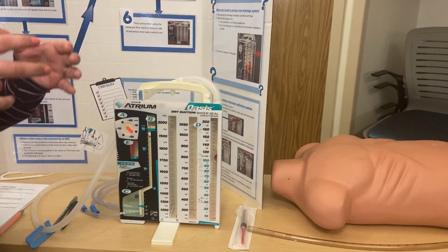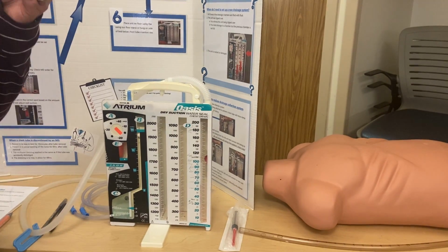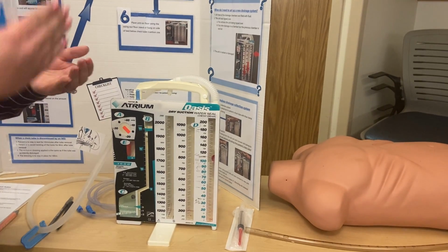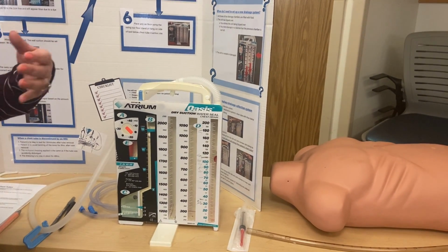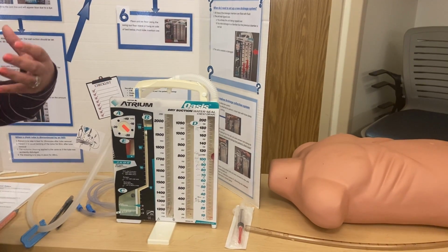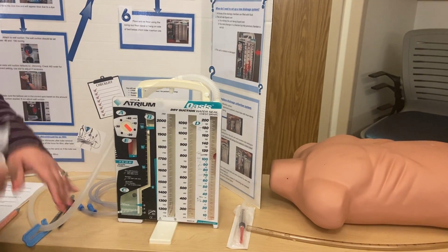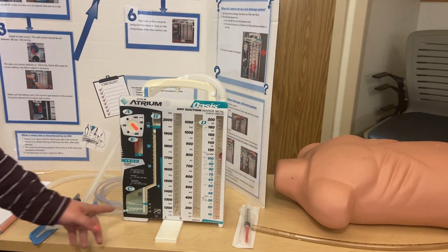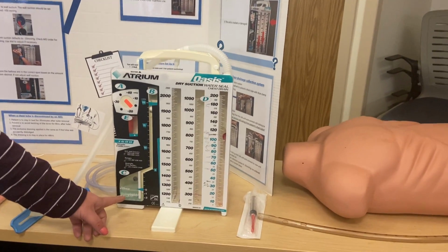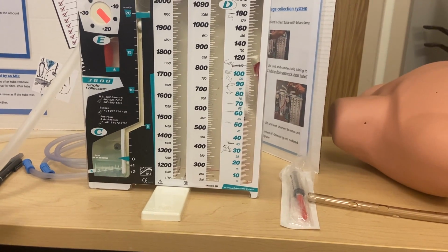So they said, if we submerge the end of the chest tube into water, that will help that air escape the chest and it will create a seal so no air can return to the chest. Because if you have air returning to the chest, it's going to either create a new pneumo or worsen one that is already there. So you always want to make sure your water seal chamber has 2 centimeters of water in it. Most people only keep a chest tube for maybe a couple days.